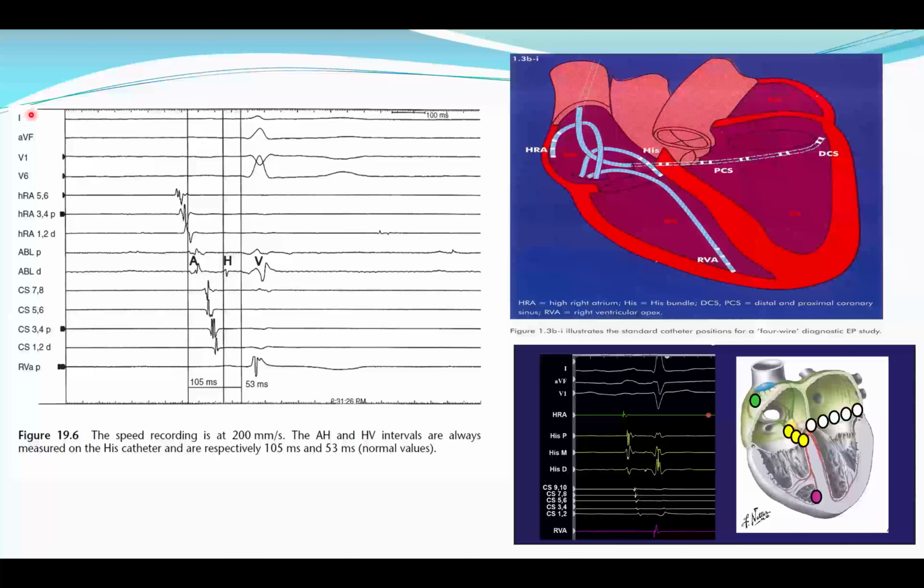So this recording throughout the procedure is important. You can see here itself, this yellow catheter, this is your His recording. And then your coronary sinus, as I said, records A. Specifically, if I put it from the groin, because it touches towards the roof of the coronary sinus, you'll have a big A signal. Far field, you can see a very low frequency signal, far field V signal. Sometimes if I put my coronary sinus catheter through the right internal jugular vein, because it goes and sits on the floor, you may have a better ventricular recording here.